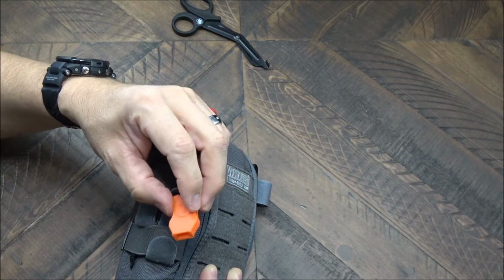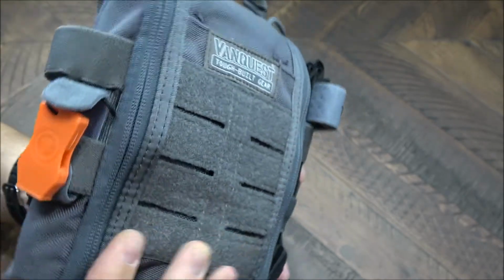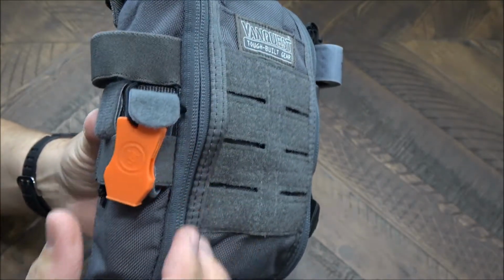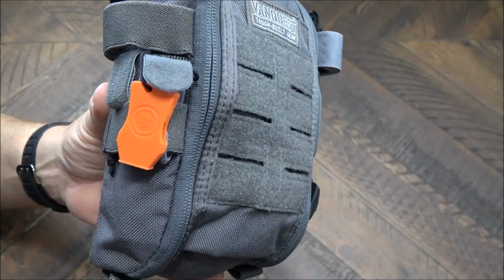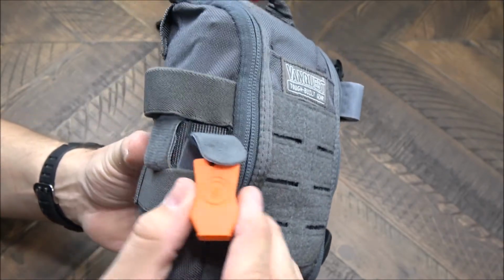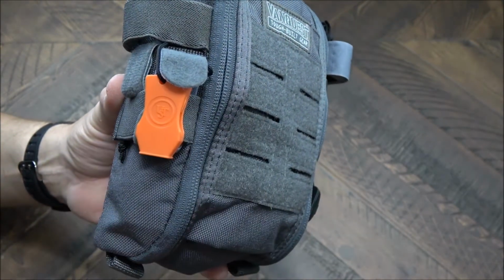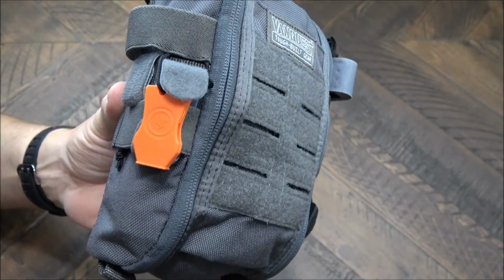This is something that you probably don't see very often in a lot of kits, but the reason for this is because if I'm in a situation where I'm trying to get people's attention, maybe I need some assistance, I can use this to signal for people. I can also use this if it's just me and I'm trying to get help for myself.